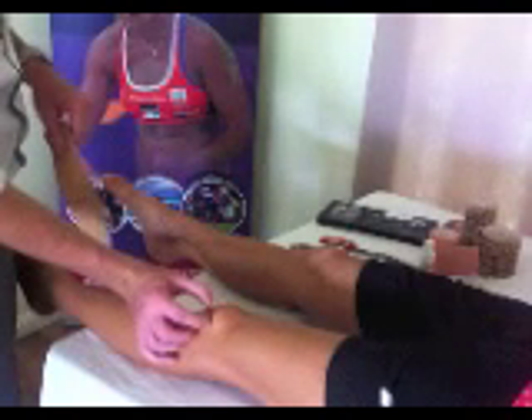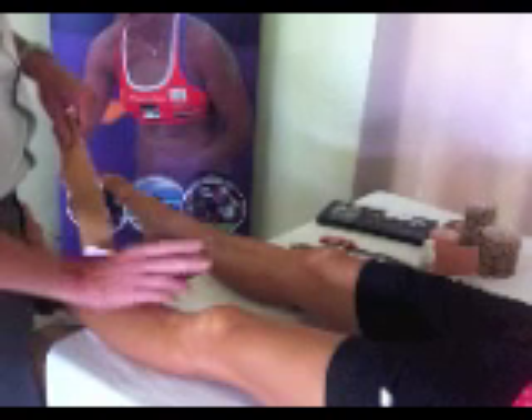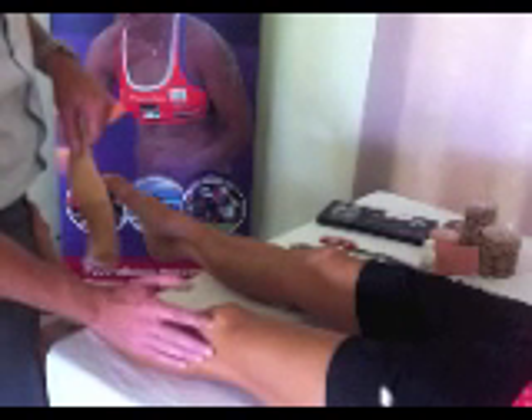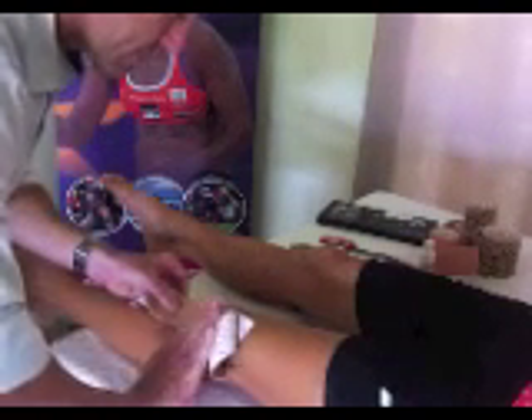In this demonstration I'll start on the patella itself. Tear your tape a little bit away from the end because we're going to start on the patella and pick up about the lateral third. If you start too anteriorly the tape will run down the front — it'll give some load absorption into knee flexion and extension but won't provide resistive force to lateral translation. Similarly, if you come too laterally you won't be in contact with the patella at all. So generally pick up around the lateral third of the patella as your anchor point.